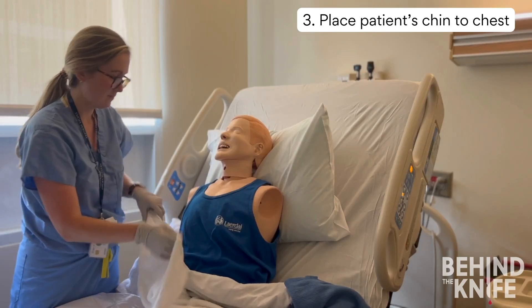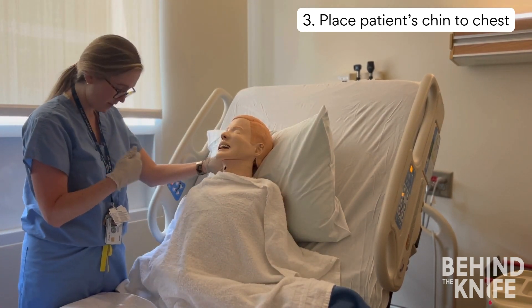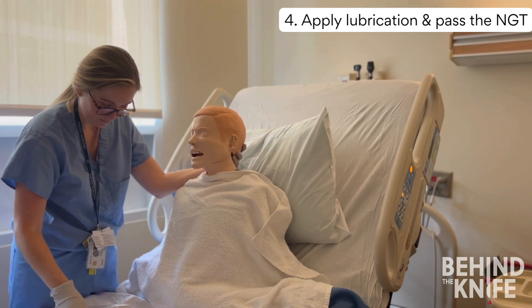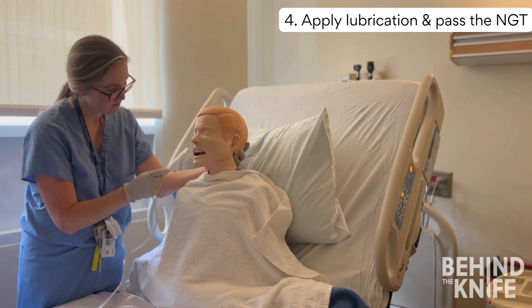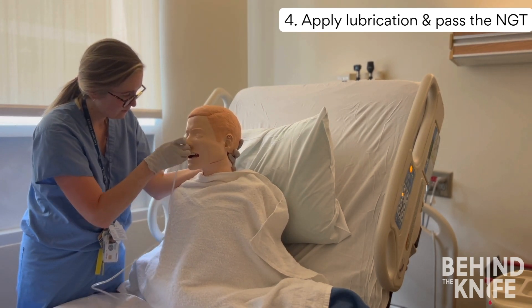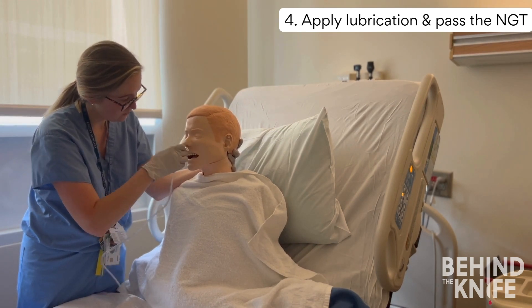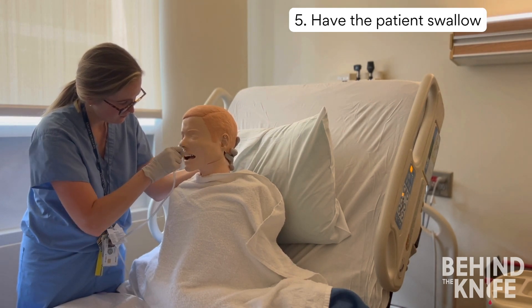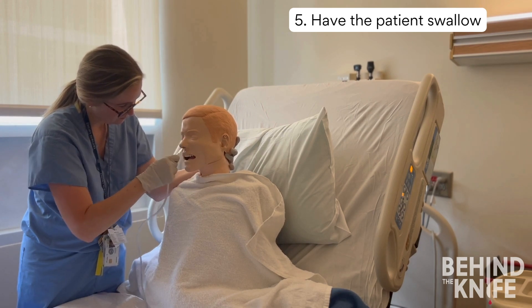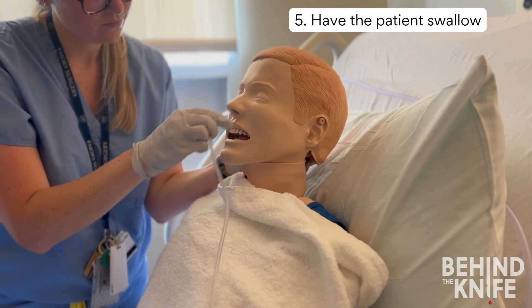Have your patient sit up and put their chin to their chest. I use my left hand to support the patient's head, as their natural reaction is to lean backwards. Apply lubricating jelly to the distal tip of your tube and insert through one of the nares. Advance by sliding along the floor of the nasopharynx while aiming posterior, until you meet some resistance — this is where you turn from the nasopharynx into the oropharynx. Apply steady pressure, then ask your patient to start swallowing and advance the tube while they swallow. This helps the tube move from the oropharynx into the esophagus while avoiding the trachea.